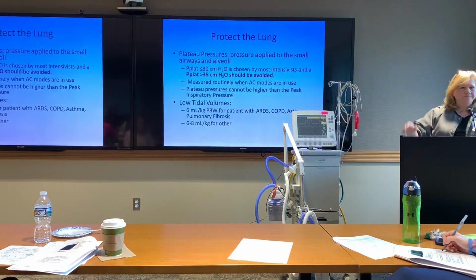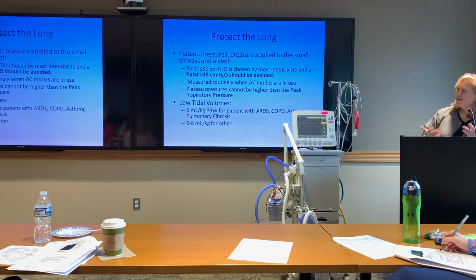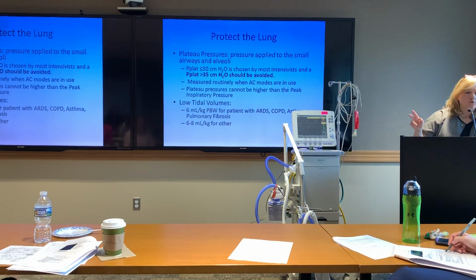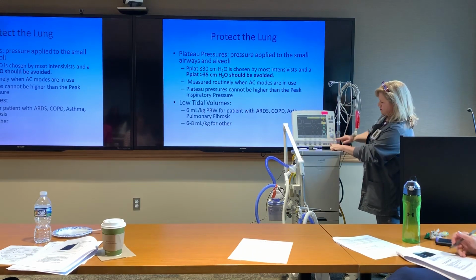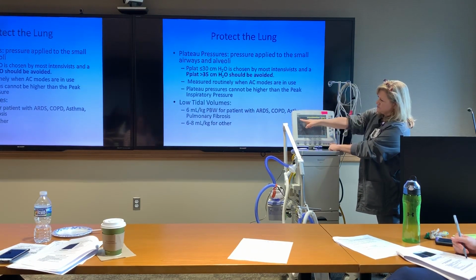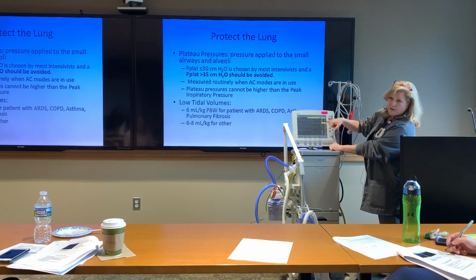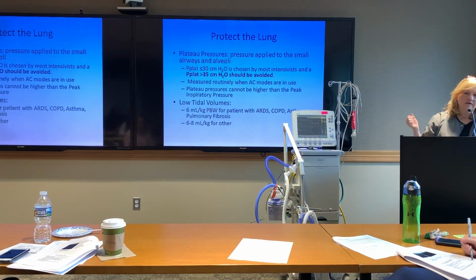Any questions so far? Is this helpful? Good. All right, so plateau pressures I was babbling about a little bit ago, talking about peak pressures, and we wonder what the plateau pressure is. As a therapist, I come up here and push this little button, and it does what's called an inspiratory hold. So the next breath is being held, no airflow is going in, and I can see that my plateau pressure is 20. Peak pressure was 21, plateau pressure is 20, perfectly normal lung. That's kind of a normal relationship.